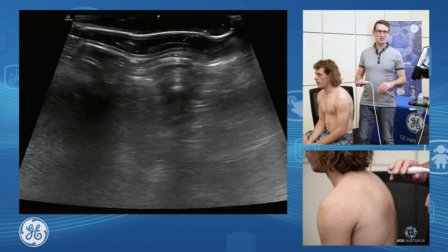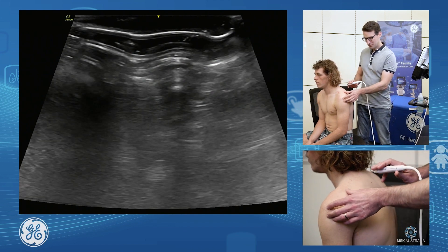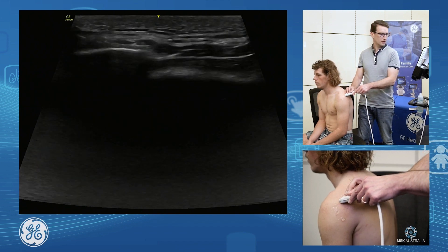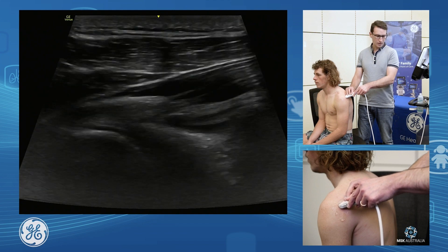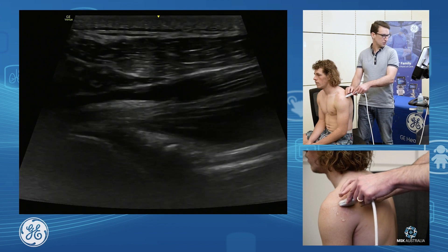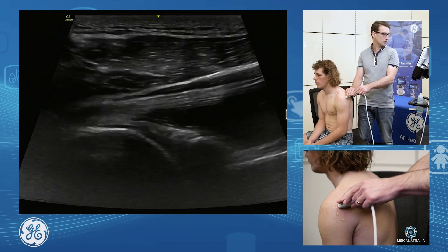I'm going to look at the posterior glenohumeral joint. The way we find this is we palpate for the spine of scapula, put our transducer on just inferior to that, and angle down inferiorly from there. I'm going to angle that medial edge of my probe inferiorly just to get a nice plane through that glenoid and humeral head.